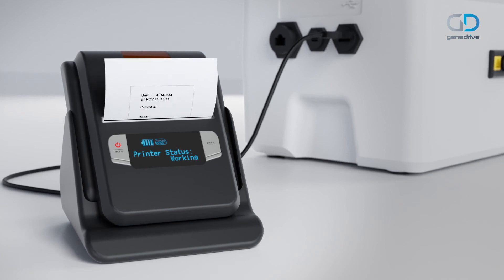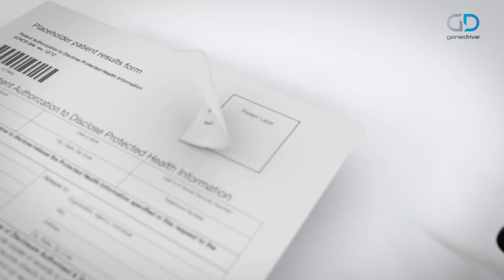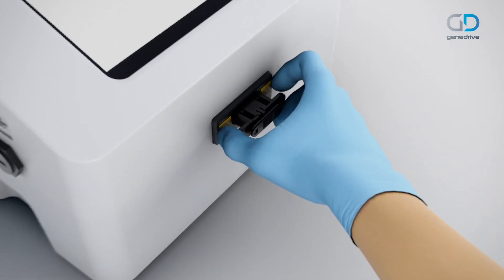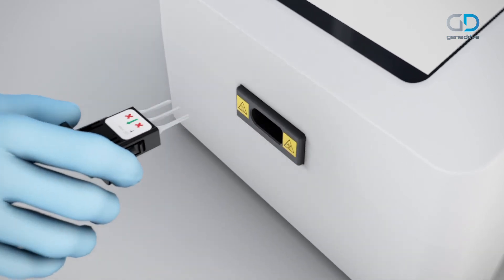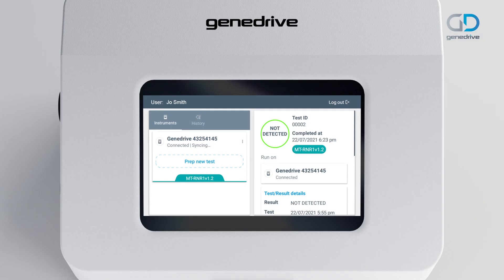If a printer is connected, print a result label using the GeneDrive system and label printer and attach to the relevant records. Remove the assay cartridge from the GeneDrive system by pressing down on the side of the cartridge and withdrawing. Dispose of the cartridge as clinical waste material. Once the cartridge is removed, you will see the Prep New Test button on the left and the last test result on the right-hand side of the screen.